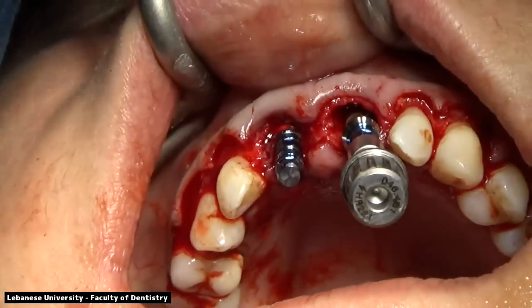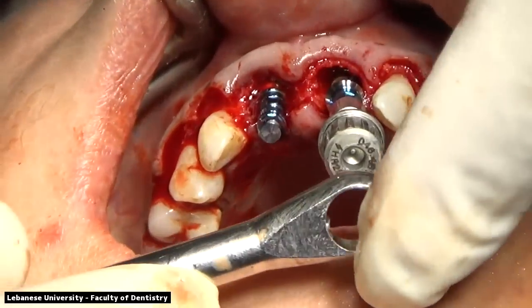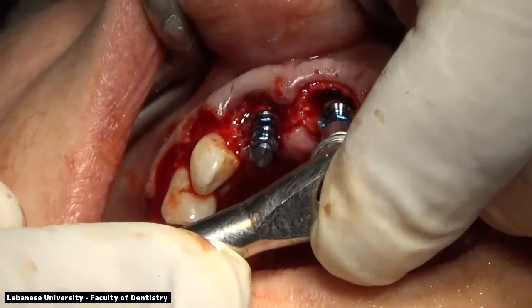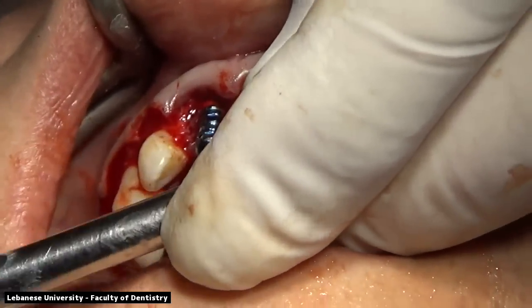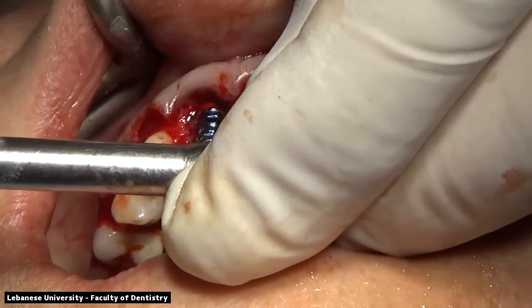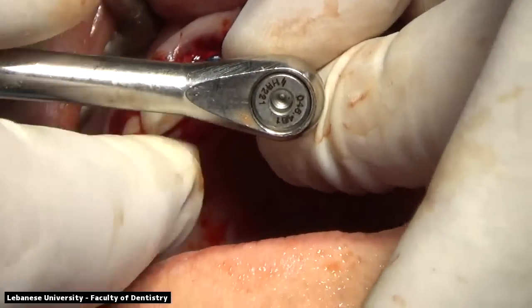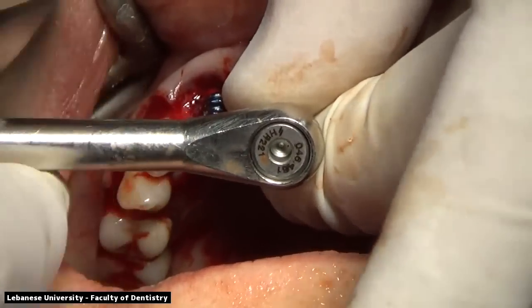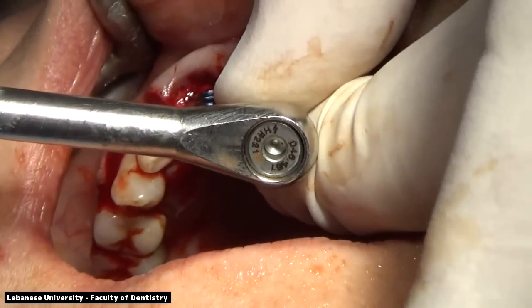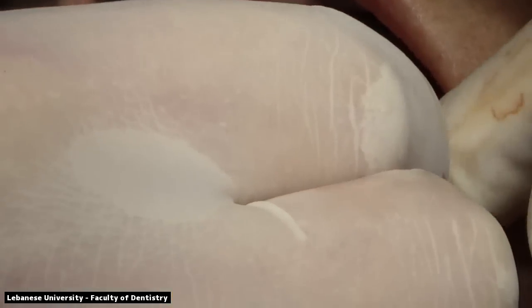Torque wrench. Because we changed the direction slightly of this implant on the left side, there was a slight mesial inclination of the head of this implant. To change it to the distal inclination and make it more parallel, the change of direction made it harder to insert the implant in the first place. Now what we're doing is we're using the torque wrench so that we can make sure that it is stable inside the alveolar bone that we created, or the socket that we created for the implant.